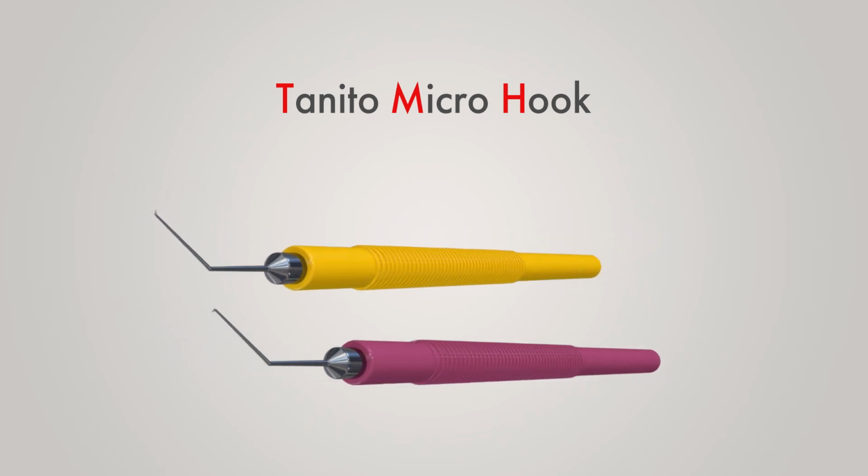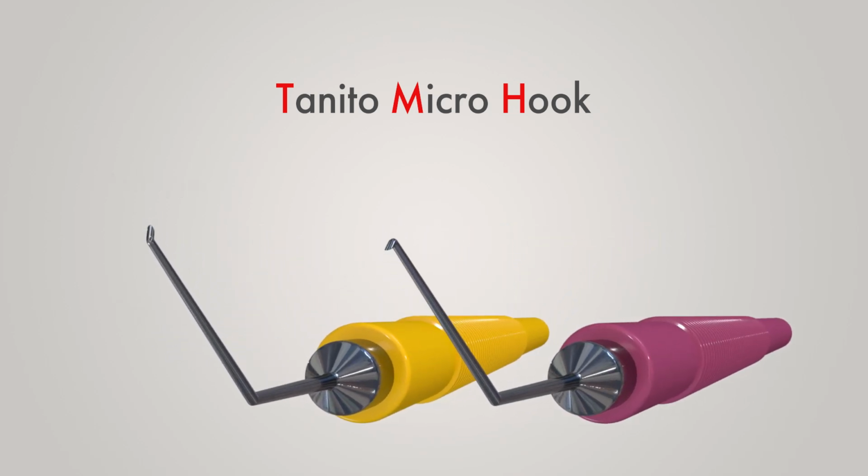There are several other hooks for trabeculotomy surgeries, but the TMH has a smaller tip, small enough to enter directly into the Schlemm's canal. It is sharper too, so the trabecular meshwork can be easily incised by moving the hook circumferentially. The spatula-shaped microhook makes it easier to insert it into the Schlemm's canal without the need for creating an entry site. This both simplifies the surgical procedure and shortens the time.